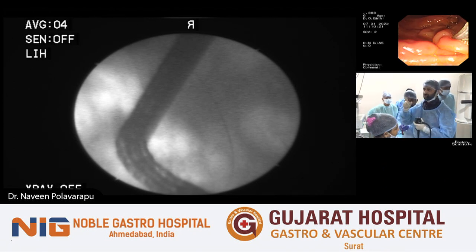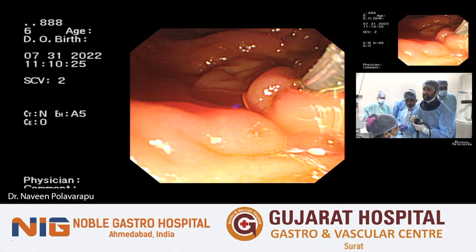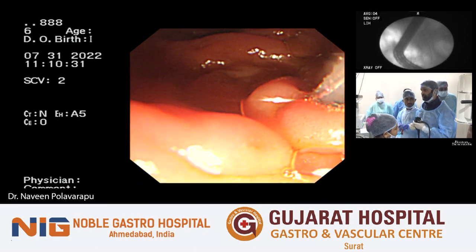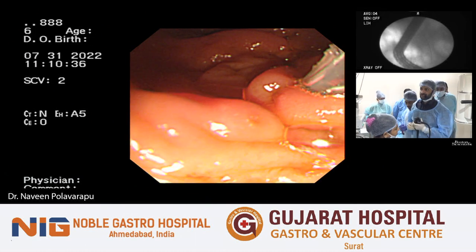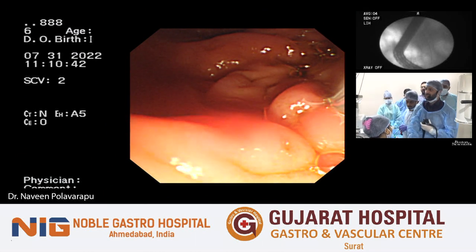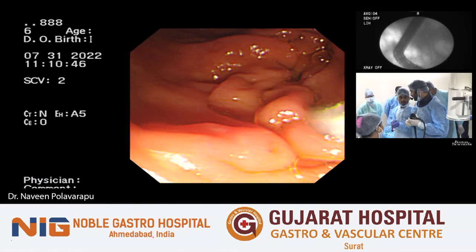So another thing which I noticed in this case is there's a diverticulum on both sides, so the ampulla is in the ridge between the two diverticula, which makes it a bit more challenging to do a sphincterplasty or sphincterotomy also. The other thing is getting the spyglass as well. But there's a good enough cut which was done before, so I think we should be able to get the spyscope in easily.